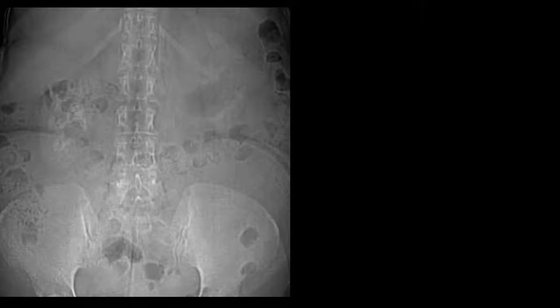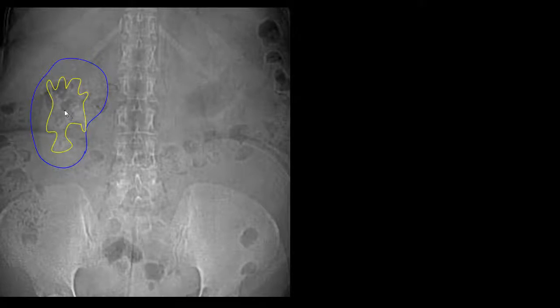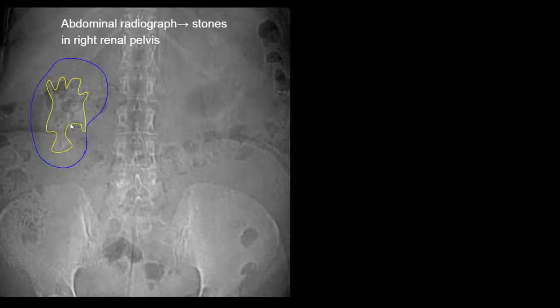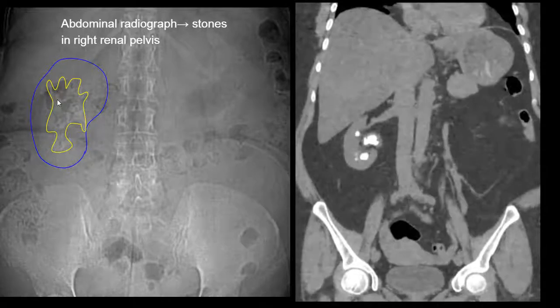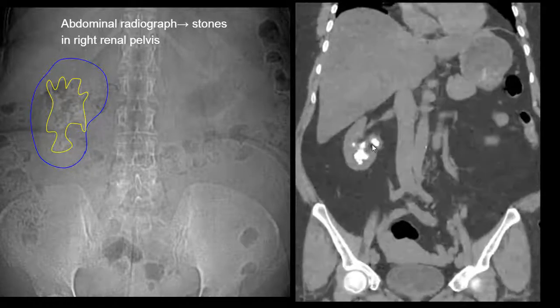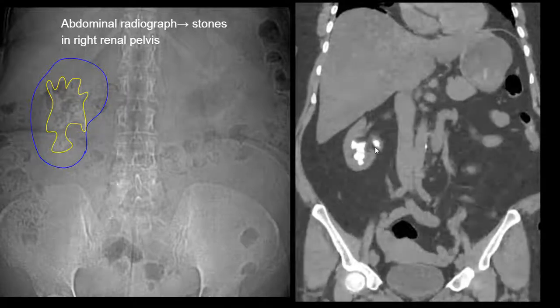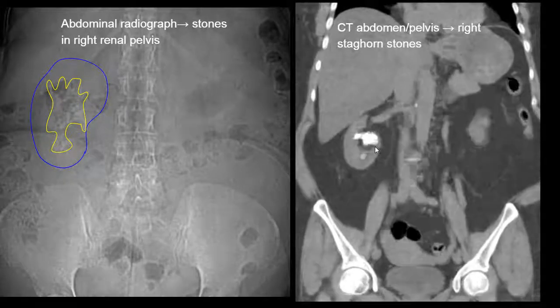Moving on to abnormal stones in the renal collecting system. Here we have a radiograph corresponding to the right renal shadow, within which we see a high-density reniform radiopaque region corresponding to stones. The stone distribution surrounds most of the calyces. CT abdomen and pelvis confirms heavy stone burden involving the majority of the calyces and renal pelvis. This is an example of a staghorn renal stone.